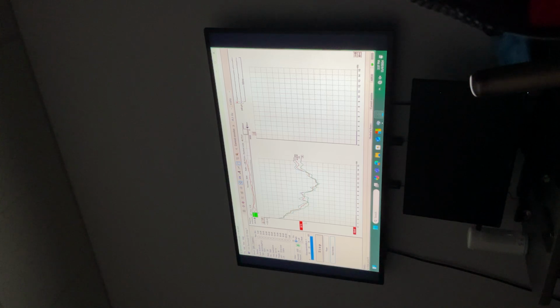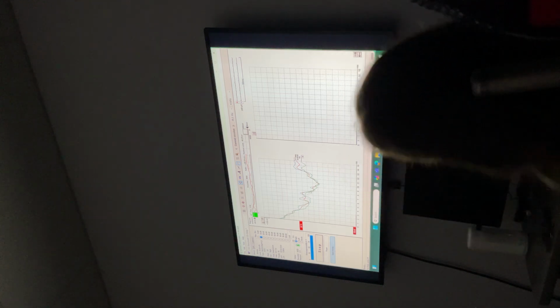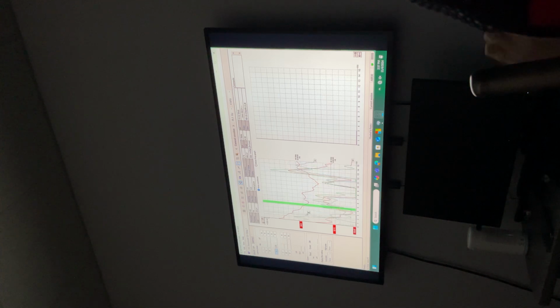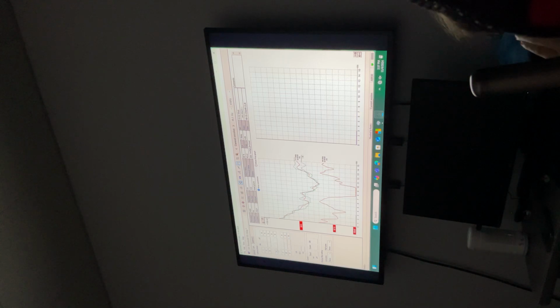So now let's go. This is 30. You agree with wave 5? Okay. Yeah. Maybe 3, you know? You're probably right. So let's go to 10, okay. So let's mark 25. Escape. So wave 5.